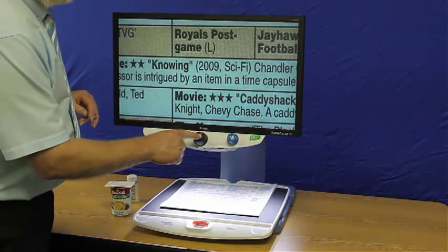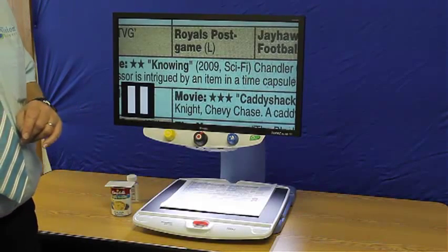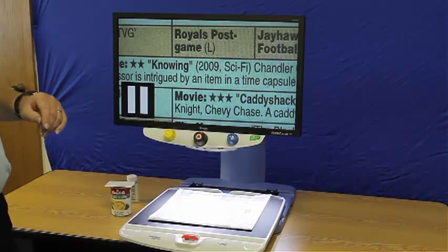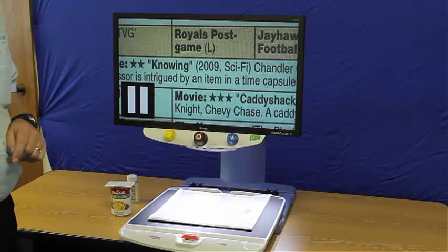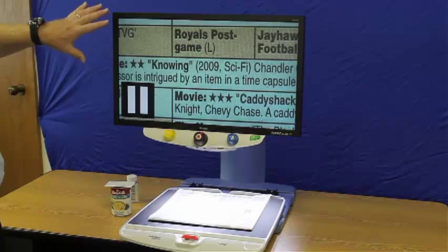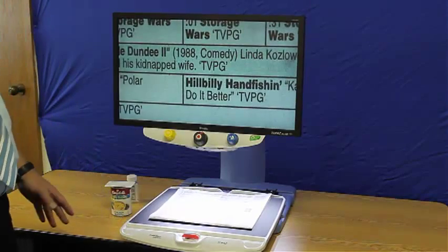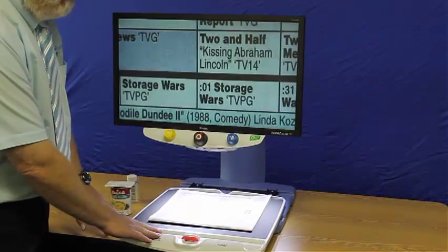First of all, the red button inside the black knob is the freeze button. What that does is take a picture of it, so when you move the paper that's underneath here, it doesn't move. It also has two bars, a pause bar, and that tells you that you have frozen it. To get it off, push it again, and we're back to normal. Notice what I'm looking at, and I didn't mention that, is the paper that's on this movable table underneath here.